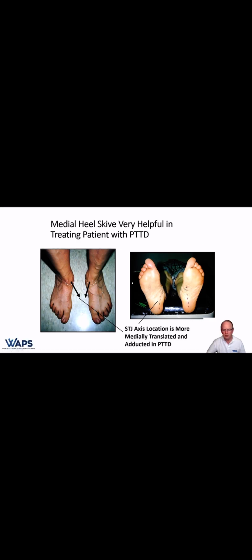Again, medial heel skive is going to be very important in trying to push medial to the subtalar axis and reduce the pain that this patient has in the posterior tibial tendon. Here we see the subtalar axis on the right foot that has a posterior tibial tendon dysfunction is more medially deviated.